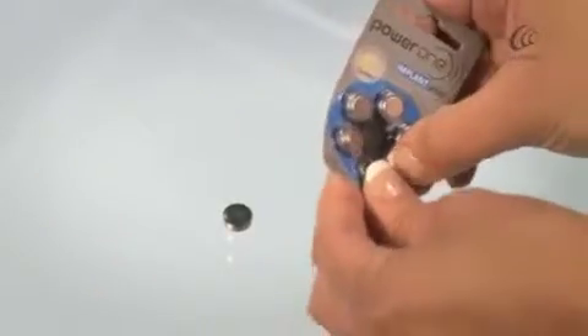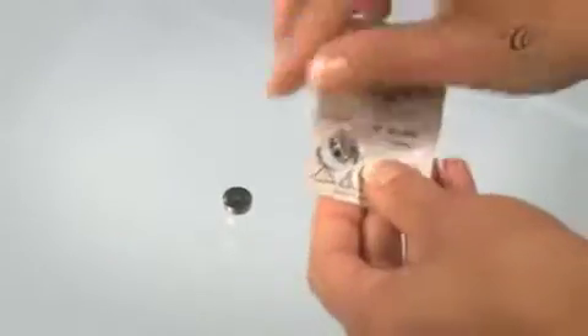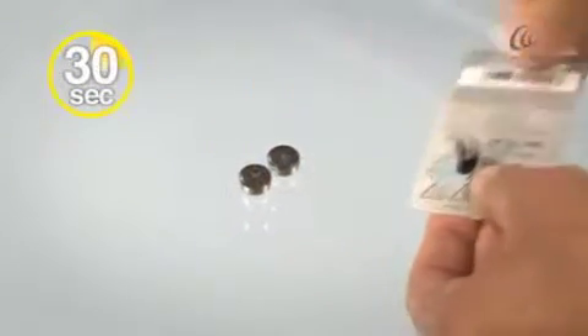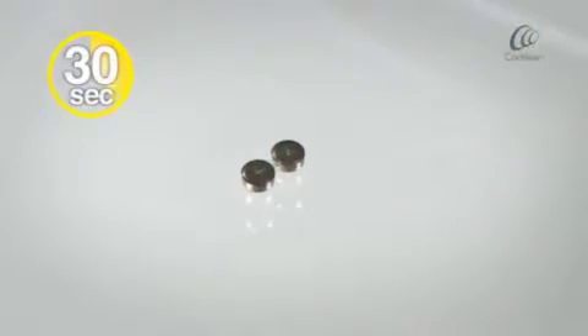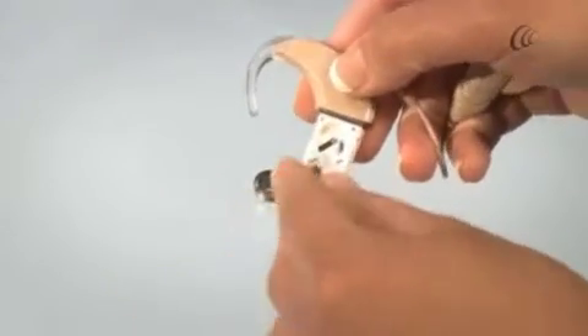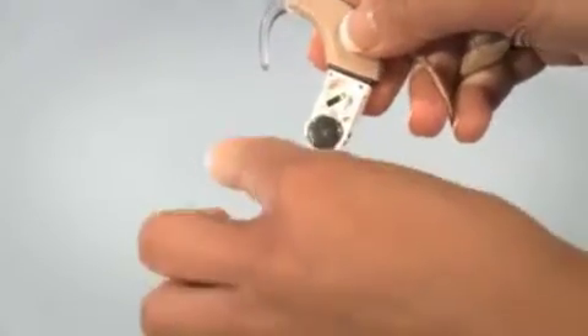Remove the new batteries from the packet. Let them sit for 30 seconds before using. This will maximise the life of your batteries. Insert the new batteries into the holder with the flat side facing up.